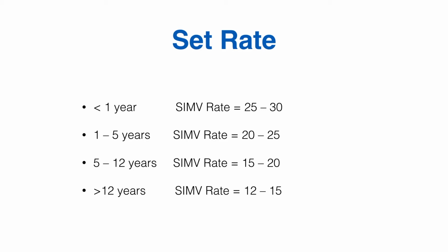And if you're somebody who's used to working in a neonatal unit, you'll probably look at the value I'm picking for a term neonate of 30 breaths per minute as being a little bit low. But the patients generally ventilate very well on 30 breaths per minute. We tend to use slightly longer I times, and quite often I'll go out to district general hospitals to find a baby with respiratory failure and hypercapnia being ventilated at 60 breaths per minute, short I times, not clearing CO2, and I'll get strange looks when I set 30 breaths per minute on the ventilator and give them decent I times, decent time to expire, and the children just clear their CO2 much better.